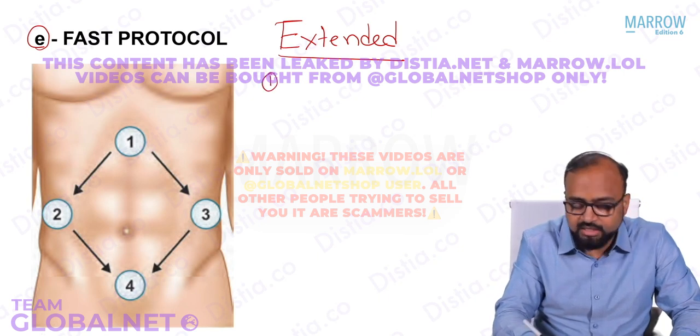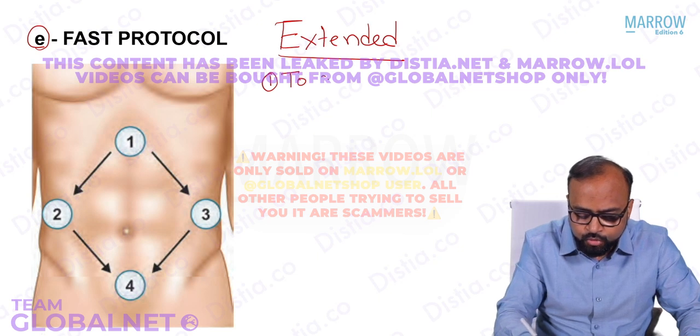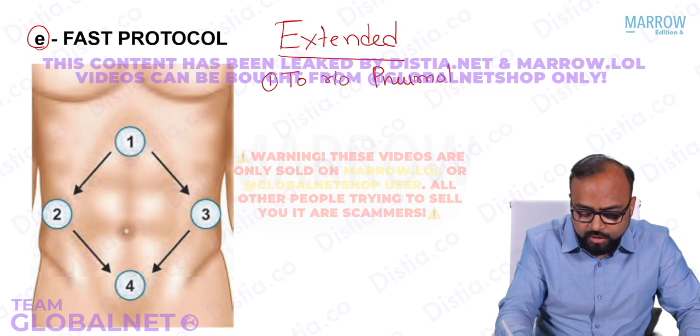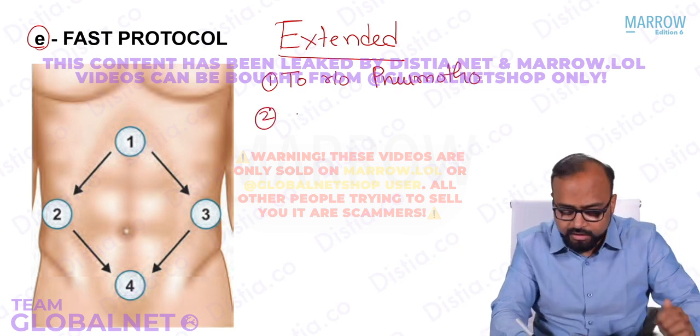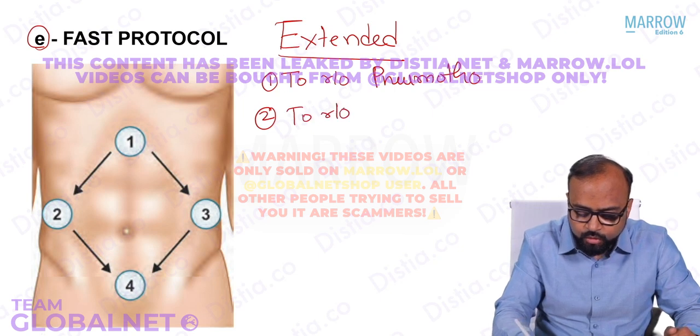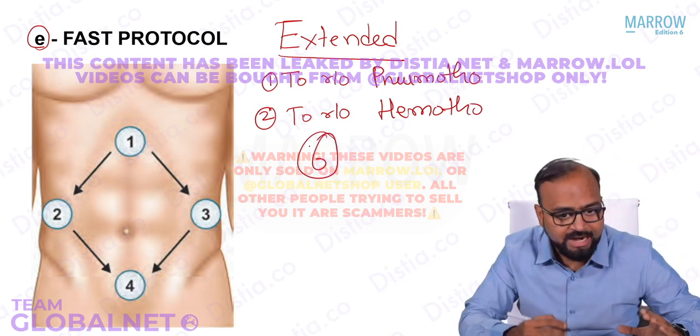One, it is assessed in the upper portions, in the non-dependent part, to rule out pneumothorax. Two, it is assessed in the lower dependent part to rule out hemothorax. So total 6 views are then obtained. 2 thoracic views are added to it.